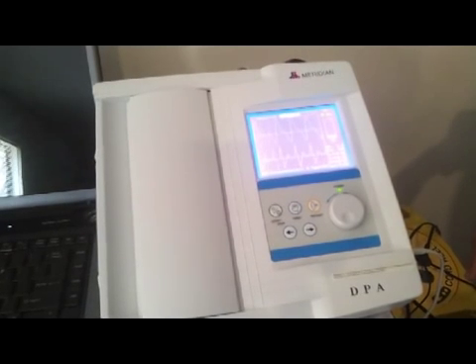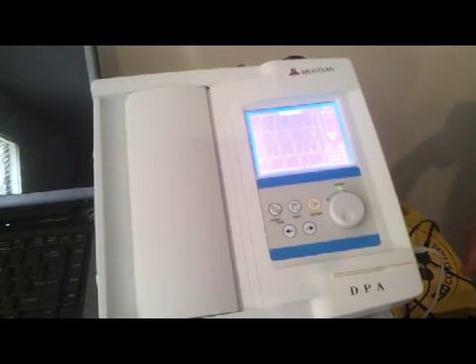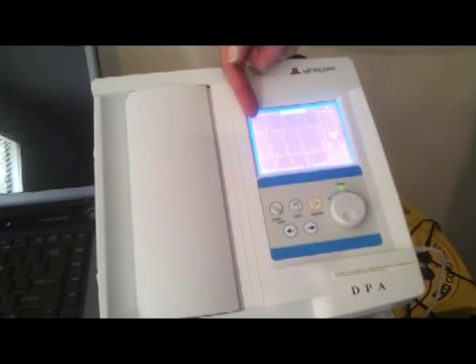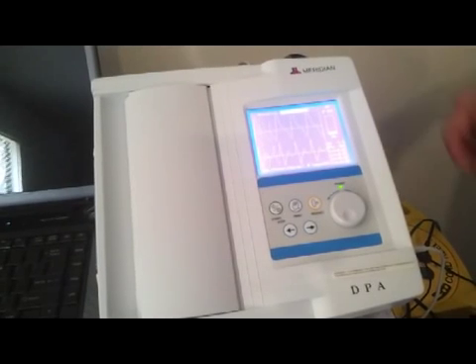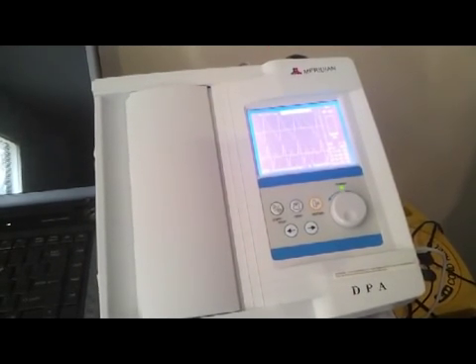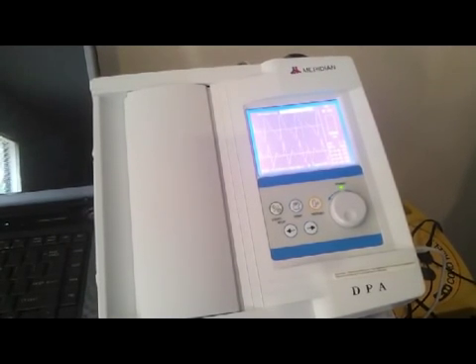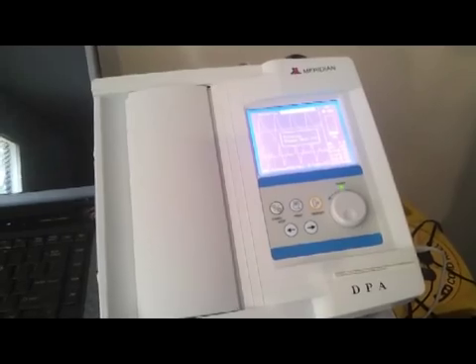We're about three quarters of the way through, almost there. You can see the top one is the PTG wave, the next one down is the APG wave. We're showing a B value most of the way through here — it looks like it's going to stay in the 30s.